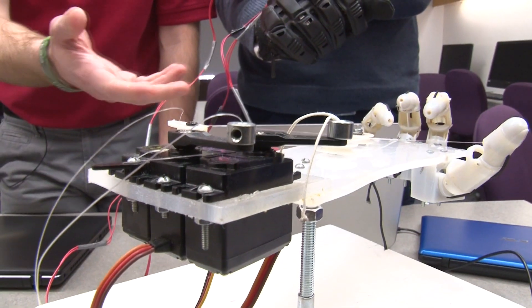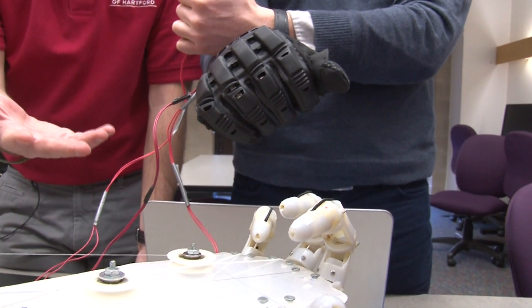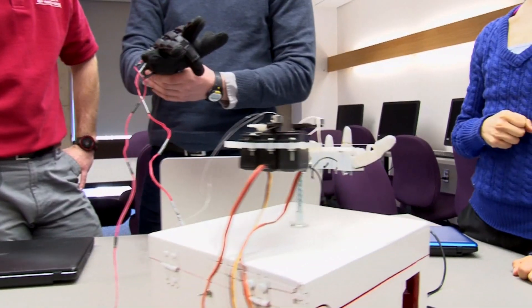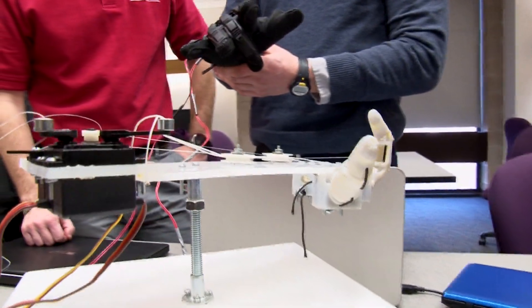This is the first prosthetic hand that can be fully customizable both lengthwise and circumferentially. You can make adjustments to any of the shapes and sizes however the patient sees fit.